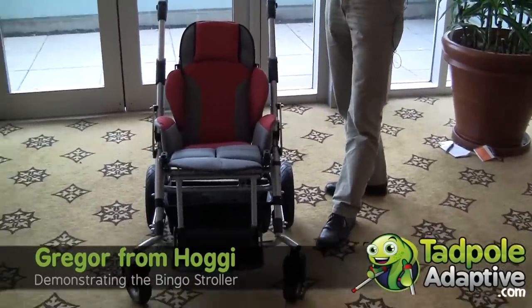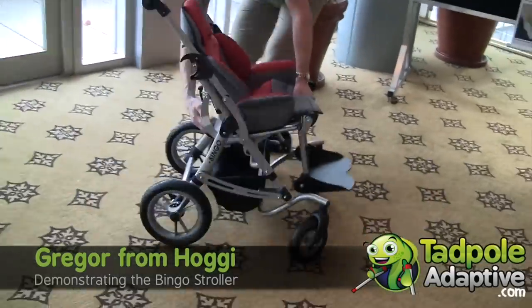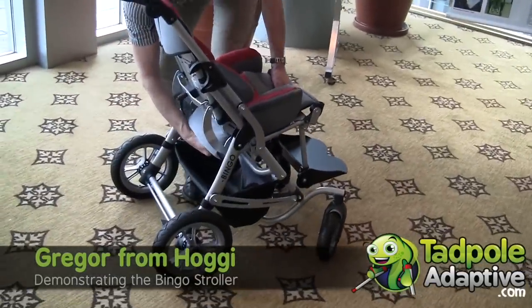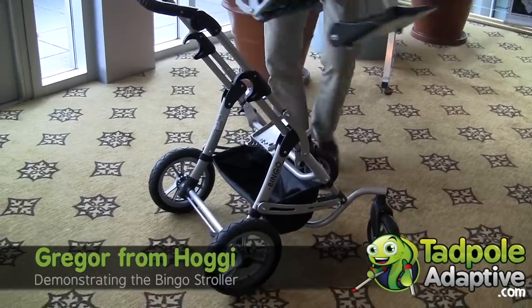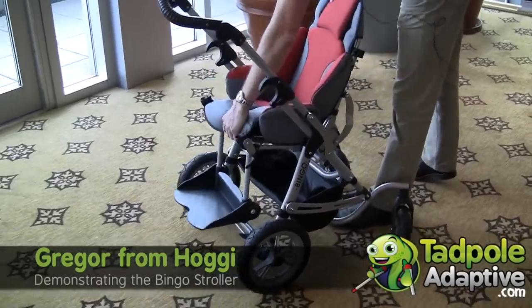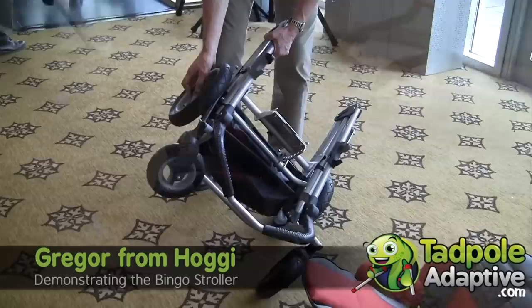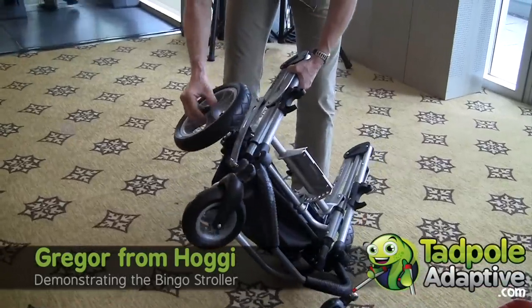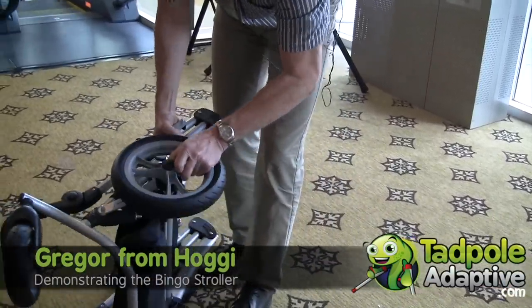To put the seat in a reverse position, we take the seat off, reverse the plate, and engage in this direction — so that it's even more compact.